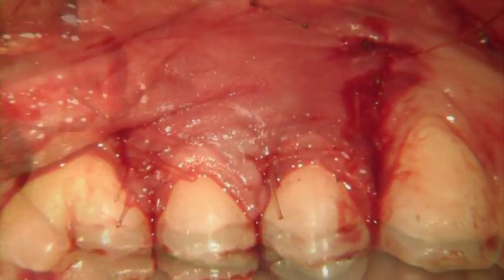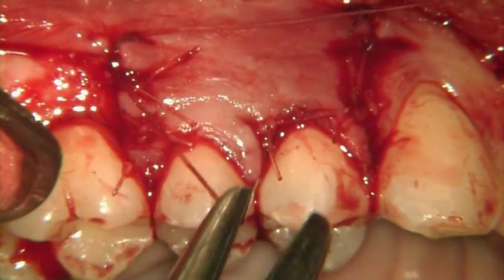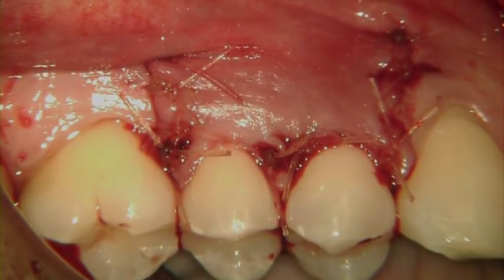Here, at the end of the procedure, hemostasis is complete, and the coronally advanced flap remains passively sutured into position. Note that the free gingival margin is now at the level of the CEJ, completely eliminating the prior gingival recession defects.